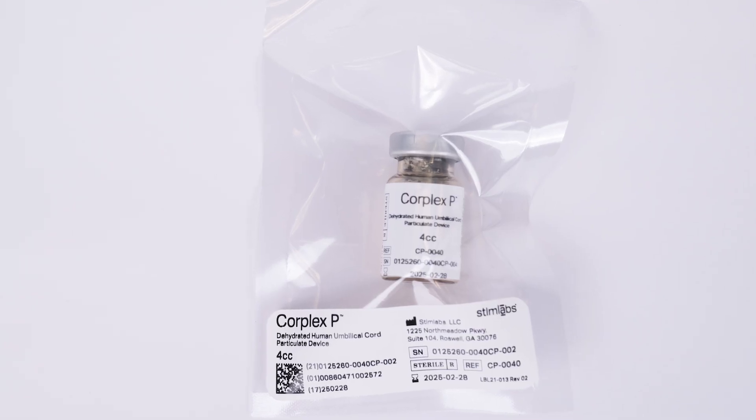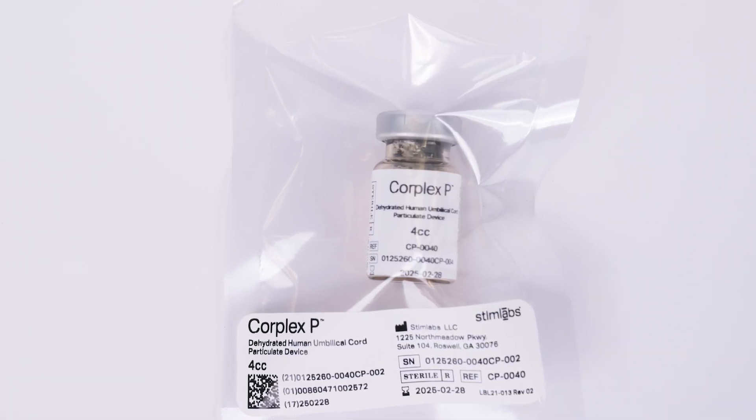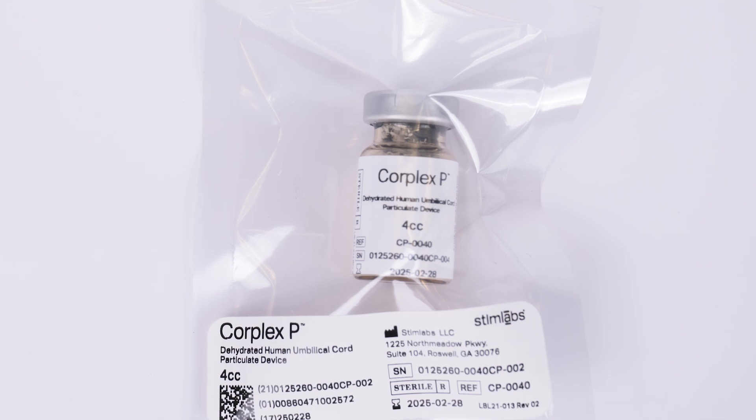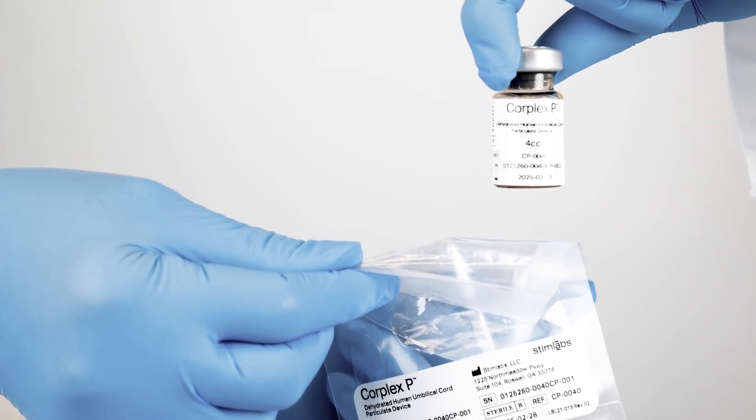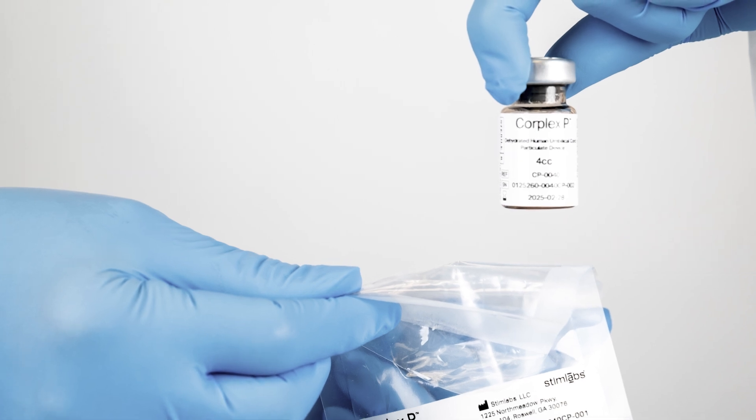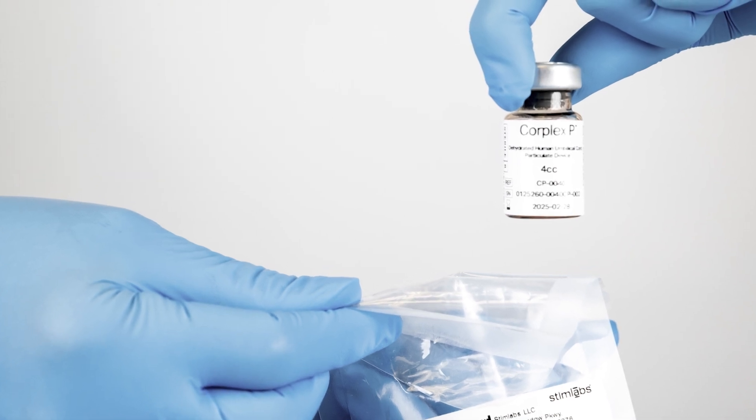The sterile barrier system consists of a clear pouch that contains the vial and the vial contents, which are provided sterile. The product vial alone is not qualified as a sterile barrier. Once the vial has been removed from the sterile pouch, CorPlex-P should either be used or discarded.